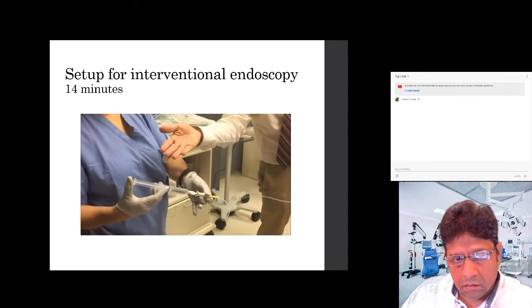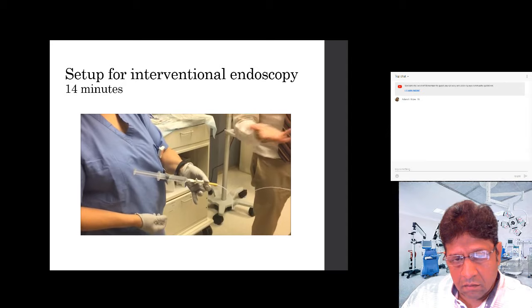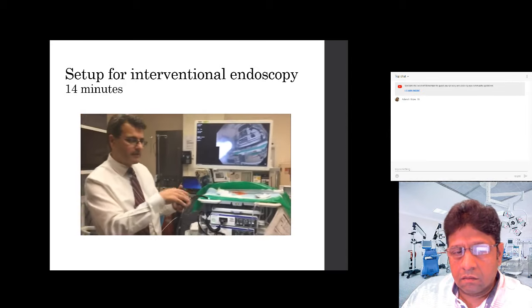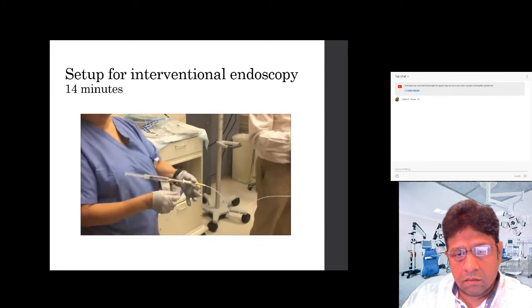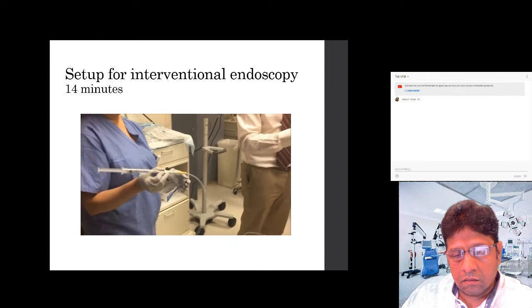And then they just inject a cc of epi, or 2, whatever the GI guy feels they want to do. 1 cc, 2 cc, just inject it in, and that's it. And when you're done, the needle comes back, so you pull the whole syringe back, and then we just take it out. So that's the sclero needle.